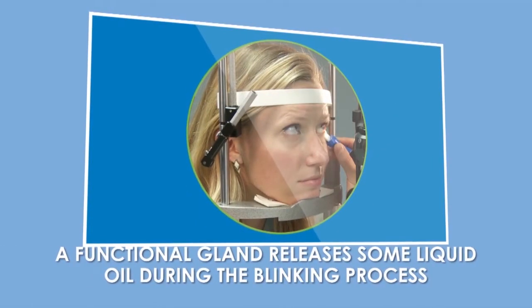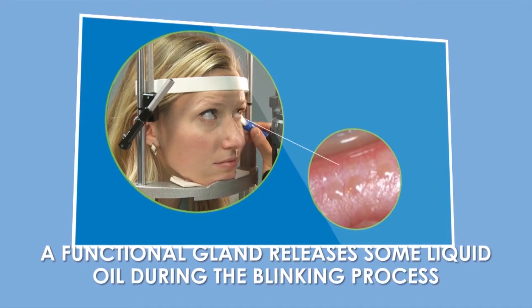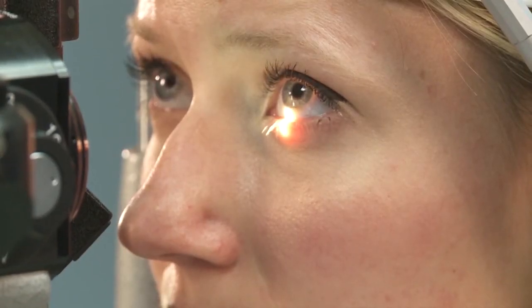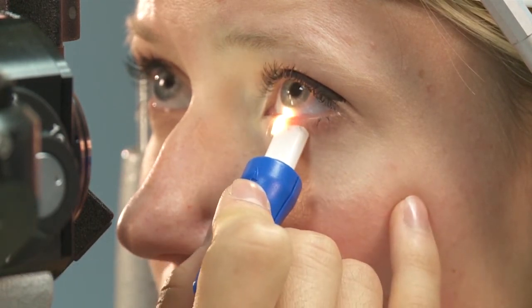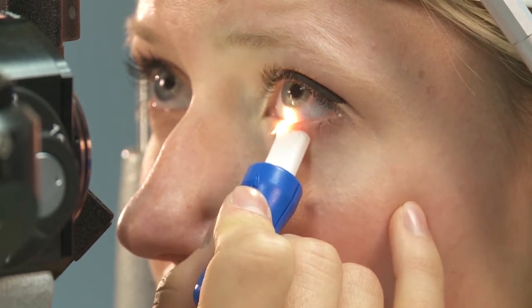A Meibomian gland is considered functional when it releases liquid secretion during the natural blinking process. The MGE simulates the approximate force of a deliberate blink over the glands. This amount of force is used to assess Meibomian gland function at the time of the measurement.